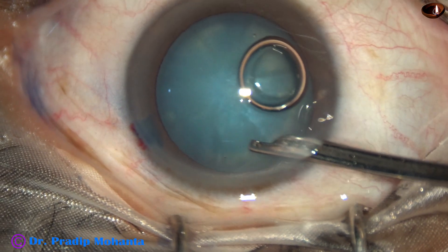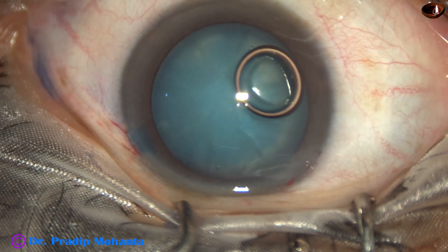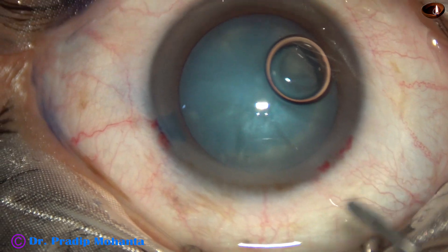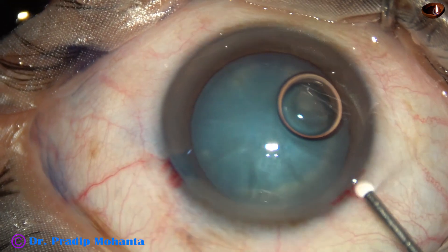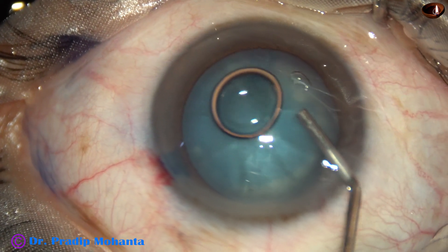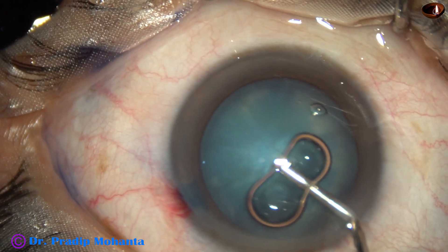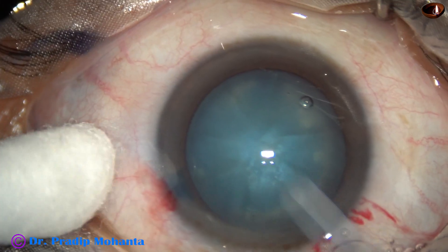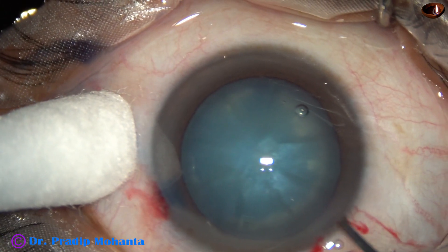The dye is washed out. And now the anterior chamber is filled up with visco — this is 2% hydroxypropylmethylcellulose.